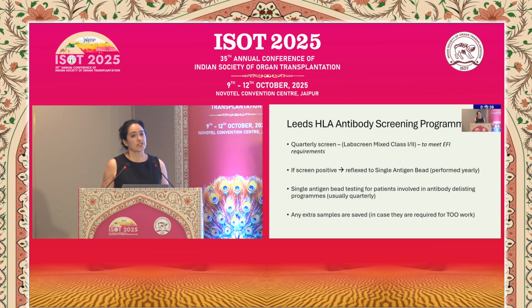We do receive a lot of samples from our recipients, and we will always store them. And we also encourage our transplant coordinators to send us additional samples if a patient's had a sensitizing event. So 2 weeks after a blood transfusion, we'll ask for another serum sample.